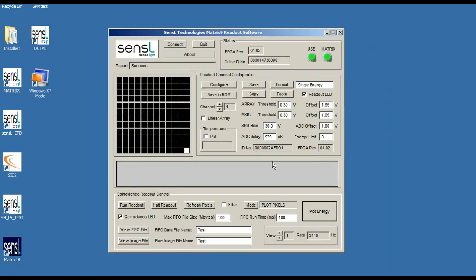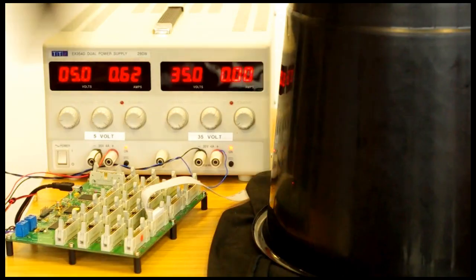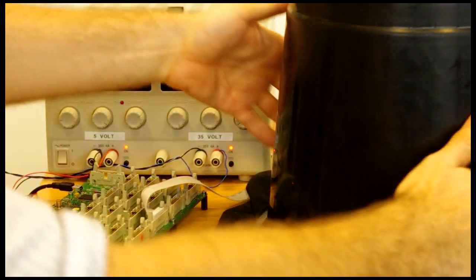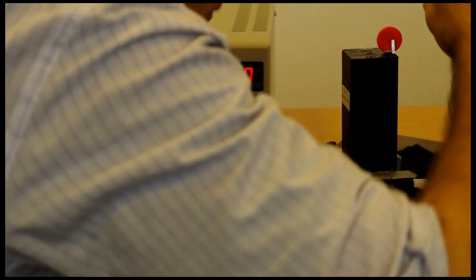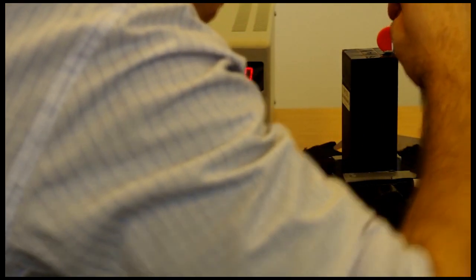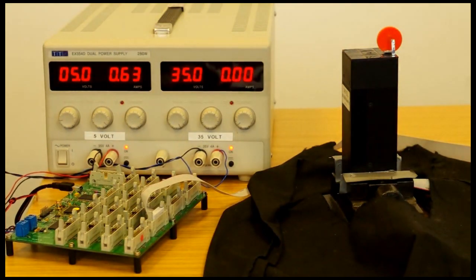We're going to halt that and take the unit out of the light-tight container and move the crystal onto a different pixel. While doing this, the unit is protected internally and you're not going to damage the SiPMs by leaving it biased — you can see we've left the bias on.